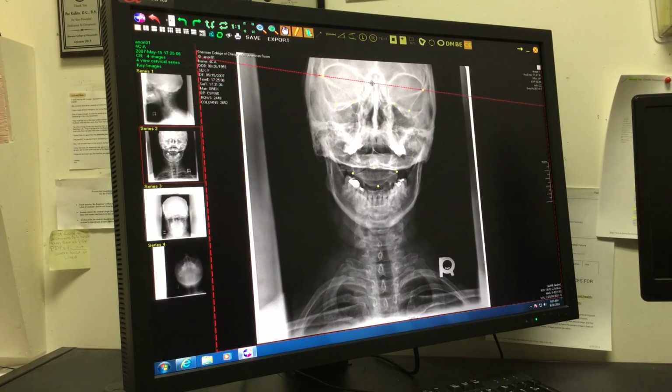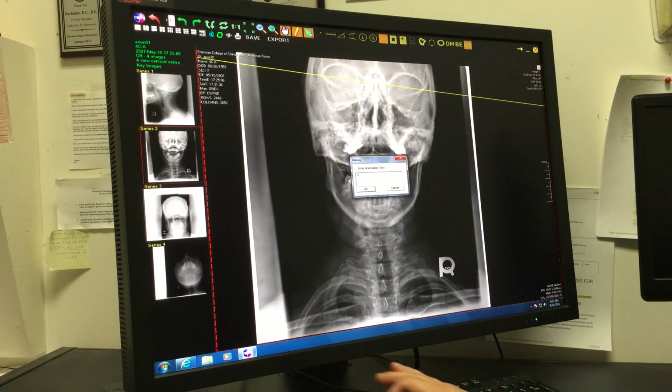So I'm going to place my superior baseline through the highest set of points, which represents that visual right head tilt, moderate right head tilt for the patient. I'm going to click on a clean area of the image to set that superior baseline there, and we're going to label it with a text box, capital SBL, for superior baseline.